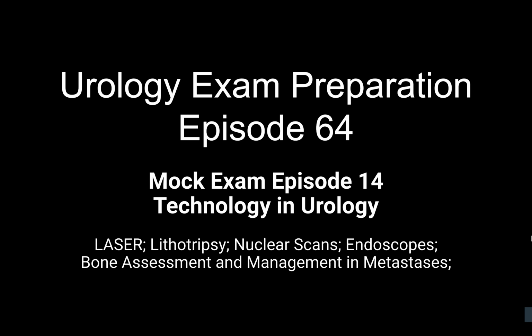afterwards. The technetium MDP will be taken up by the new osteoblastic neobone formation hydroxyapatite crystals, and it will form hot spots in the gamma camera, and that can be picked up by the gamma camera. So the increased uptake areas are considered to be metastatic deposits. However, it can give false positive hotspots when there is a history of any trauma, any metabolic bone disease, or a history of Paget's disease. That's why we have to give the history in the request form regarding any of these factors present before requesting the bone scan.